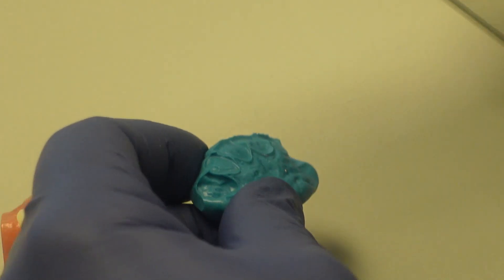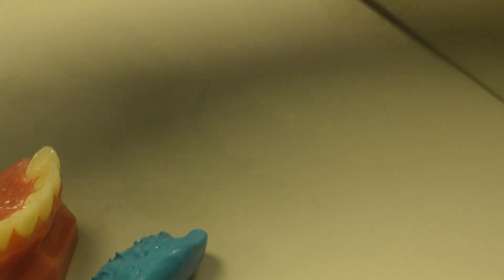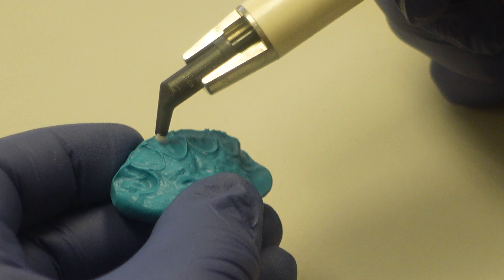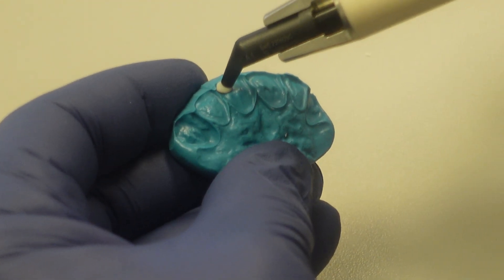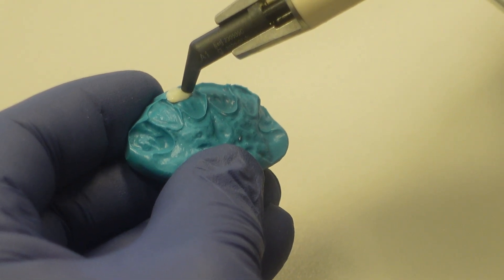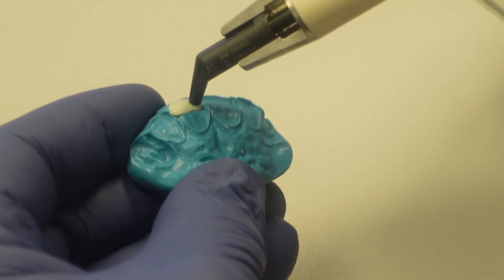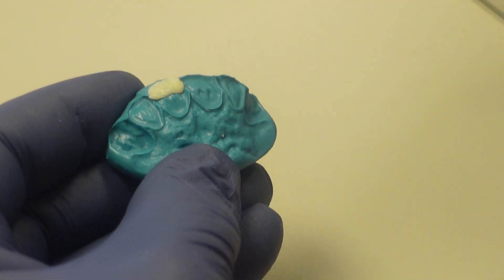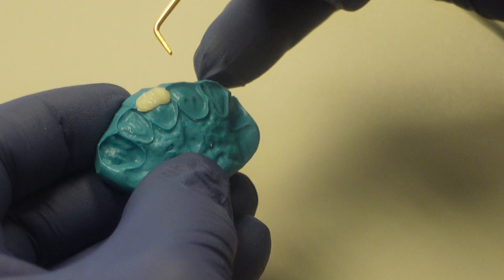We're going to use microhybrid. The Renamel microhybrid is my absolute favorite material. I'll extrude a little bit out of it first, and I like to dispense it so that it just spreads out. You don't want to end up with a sneaky pile of this stuff, so you want to just slowly extrude it so that you're not getting as many possibilities of trapping air bubbles.